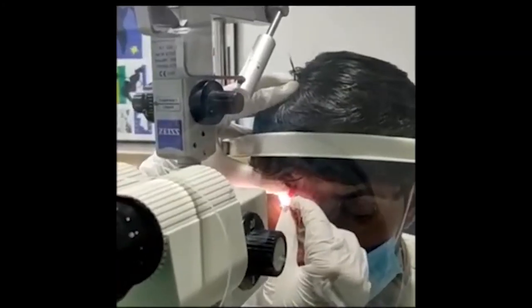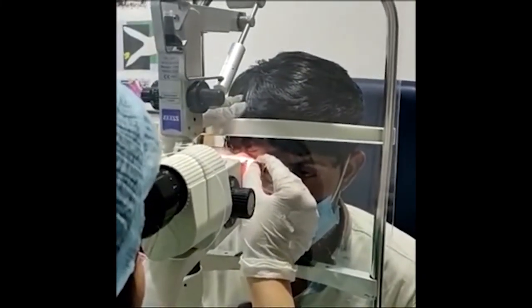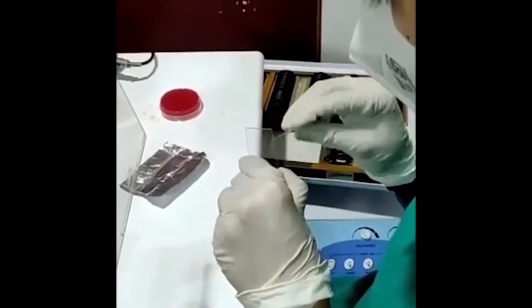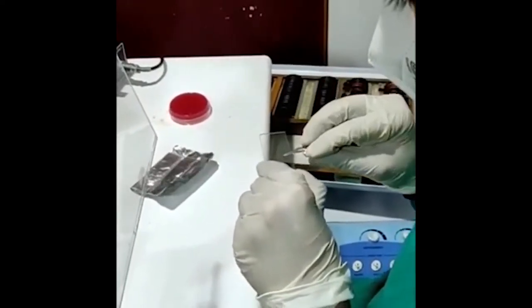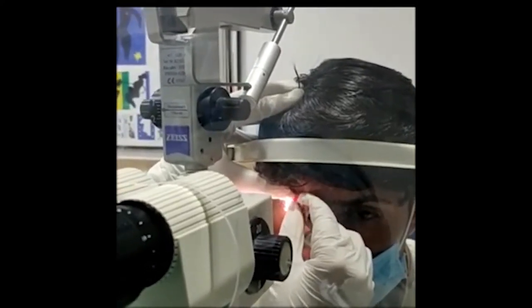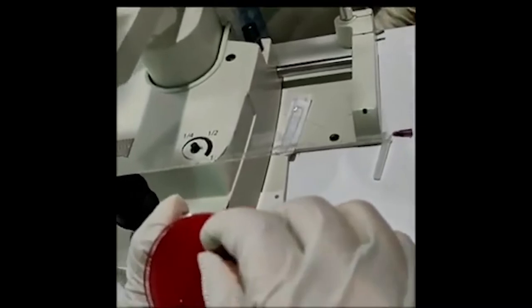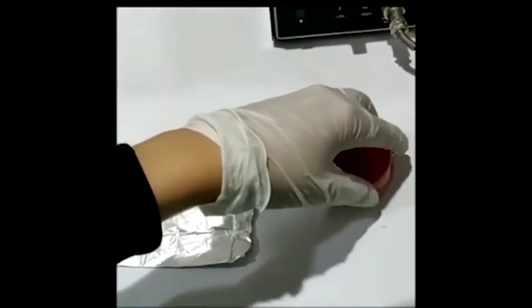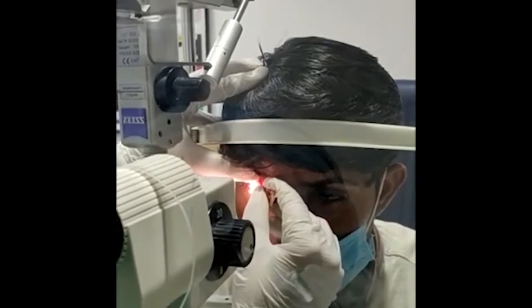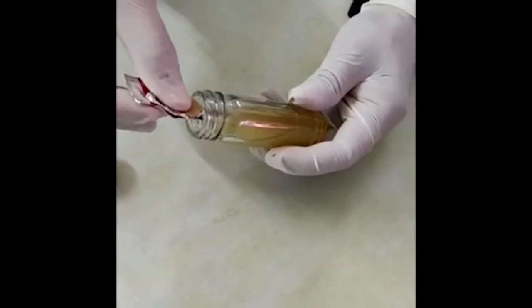Tissue is collected and inoculated on a clean glass slide. Again using a fresh blade, the procedure is repeated and the tissue inoculated on another clean glass slide. Using a fresh blade, corneal scraping is done and tissue is inoculated on agar plates without breaking the surface, in a C shape from outwards to inwards, to appreciate the growth of organisms better. More material is taken and inoculated on Sabouraud's dextrose agar, taking care that the tip of the blade goes directly into the media and does not touch the culture bottle.